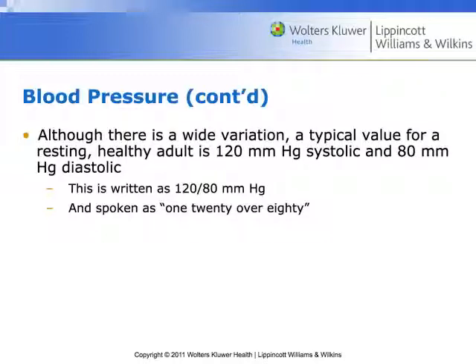So before I even start the injector, I can know, okay, this is what the person's blood pressure was prior to injection, right? If something happens post-injection, then I know prior this is what it was. Now we've got something going on, right? The person's in shock or whatever. We'll see that blood pressure start to fall off. So, and this is pretty straightforward stuff.